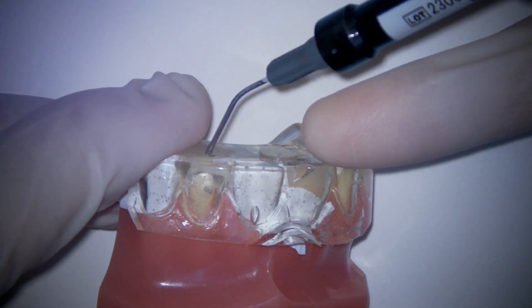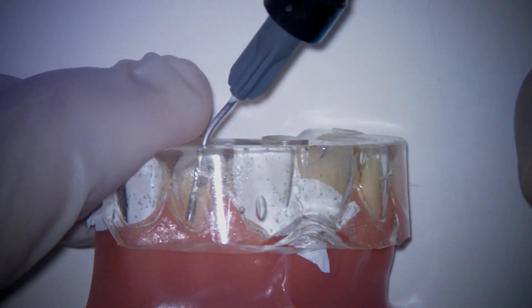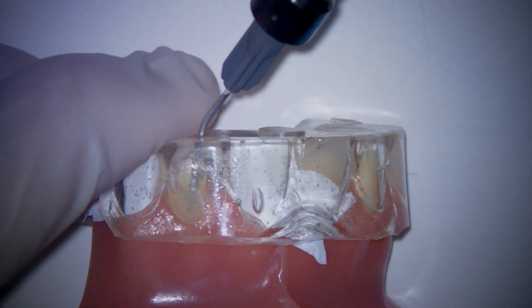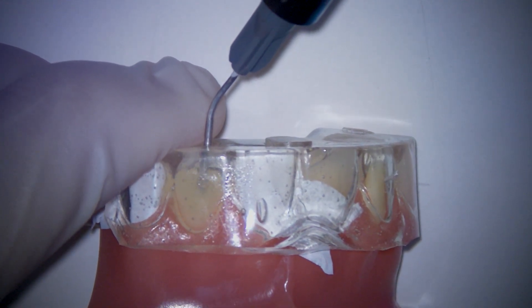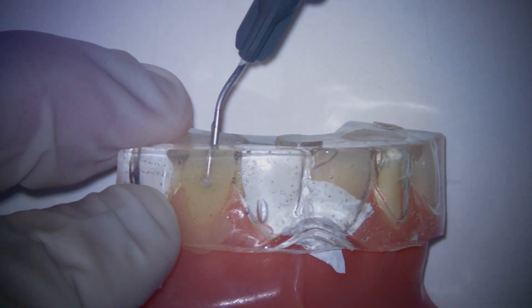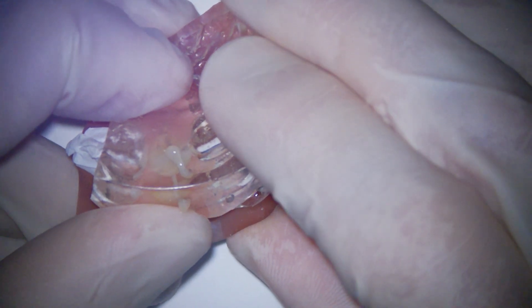Now we are ready for the injection process. We are going to take our injectable composite, take our tip, and insert it all the way down to the cervical. We are going to start to extrude our flowable composite, and as we are doing so, we are going to slowly back our tip out. It is important that we are injecting the entire time — this is very critical to help avoid air bubbles. We really want to continue to inject until we start to see the composite coming out of that facial port, just like we do here now. Looks like we don't have any voids, no air bubbles.